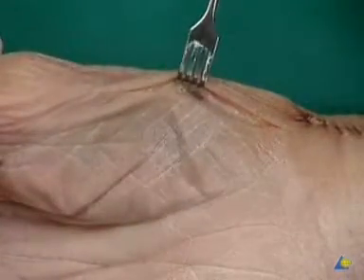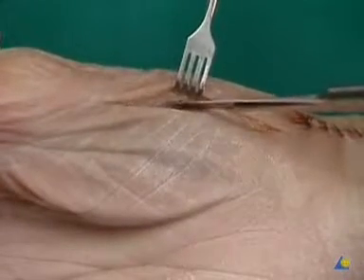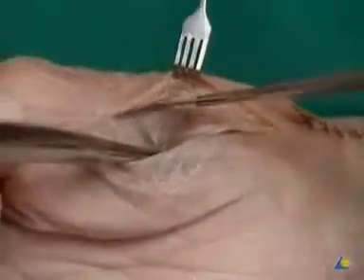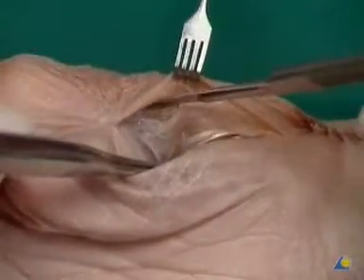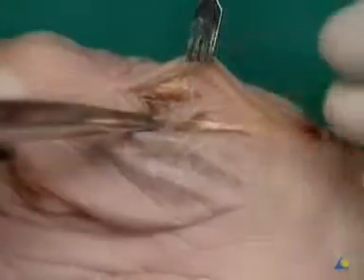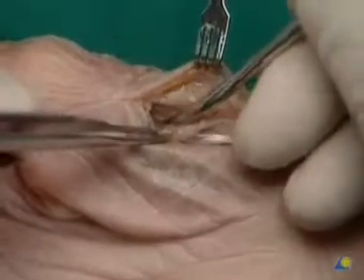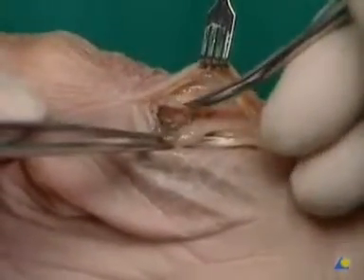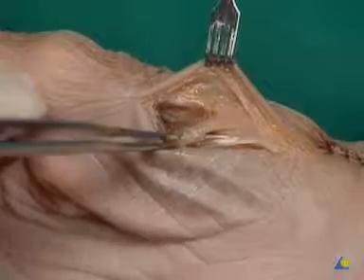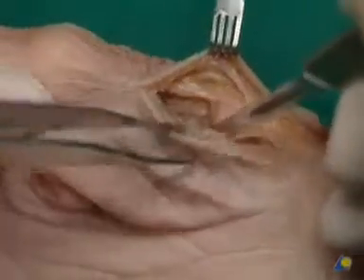A hook is used to retract the skin and soft tissue mantle in the dorsal direction. The thenar musculature is now visible and can be pushed in the palmar direction with the periosteal elevator. The dissection is completed near the base in the direction of the joint capsule with the scalpel.